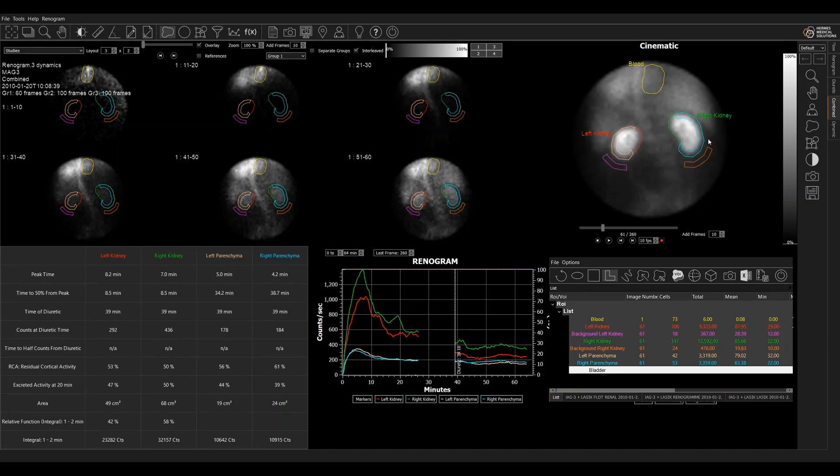The application can be configured to be exactly how you want it. So the layouts, the summed frames, the results that are calculated, the graphs that are displayed, they can all be customized, all configured to match exactly your local protocol for renograms.